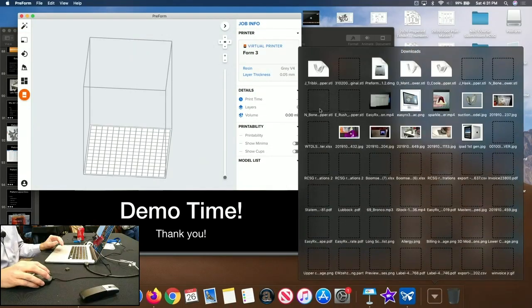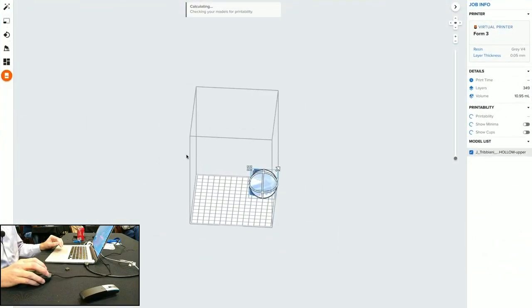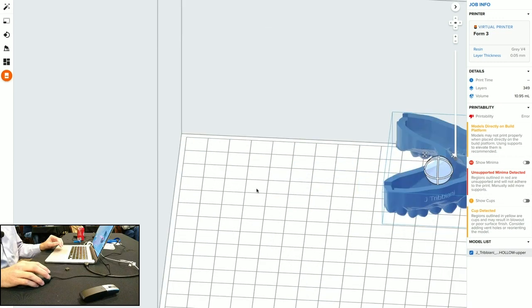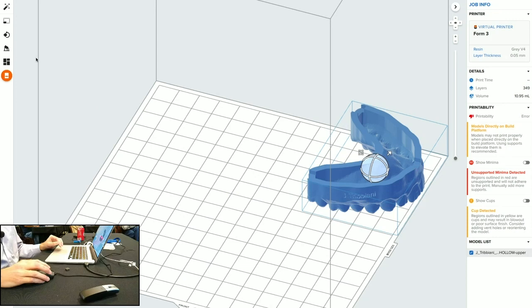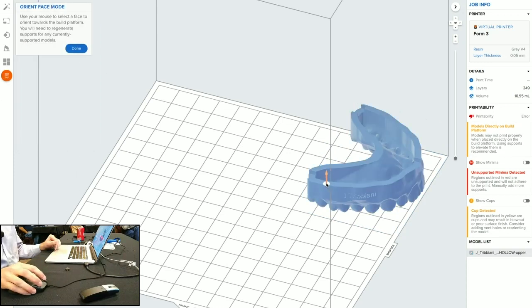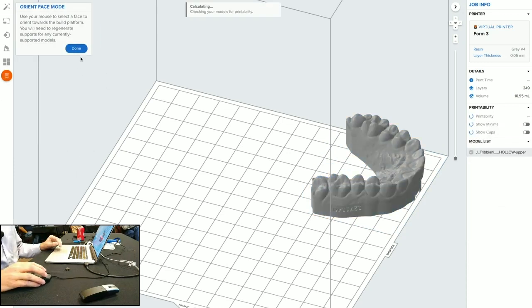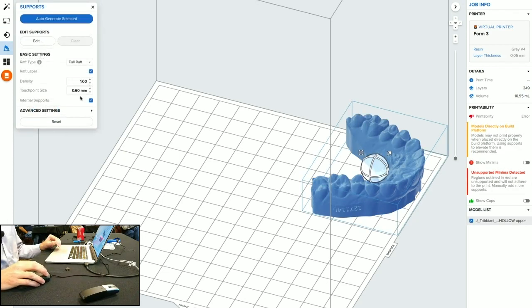So then there's the STL file, and I can just drag it over. But for some reason, when I drag it in like this, it's always teeth down. But when I do it through EasyRx, it's always on the base. So I can go here and select base, and I'm like, okay, this is the bottom. So then it flips it. Done. Then I can do supports and do no raft type.